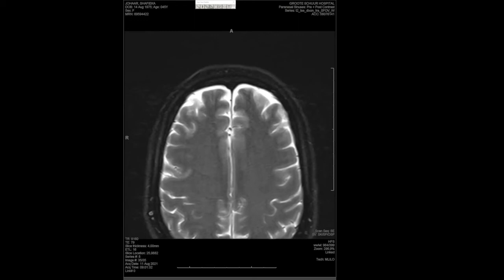So invasive granulomatous fungal sinusitis can have similar imaging features to chronic fungal sinusitis. It's typically a large expansile mass, and they typically destroy the bones and have local invasion. On CT, they're usually hyperdense with homogeneous contrast enhancement. And on MRI, they're usually hypointense on T2, but they generally have intense homogeneous enhancement. Yeah. Okay. Thank you.